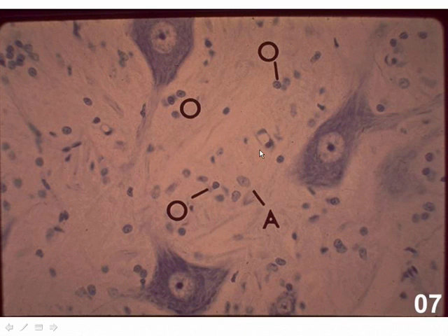Up here you'll see a third cell type, and that is the endothelial cell wrapping around this blood vessel, which, even though we don't know the vessel types yet, could be a capillary or venule, but you don't need to worry about that. Just be able to identify the endothelial cells that we learned about in the epithelium lab.